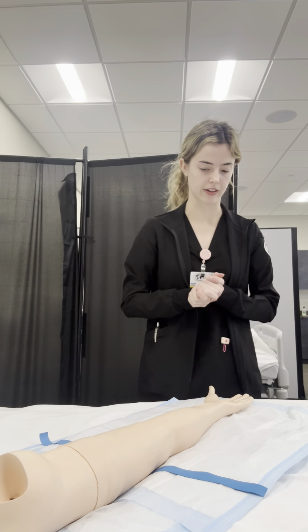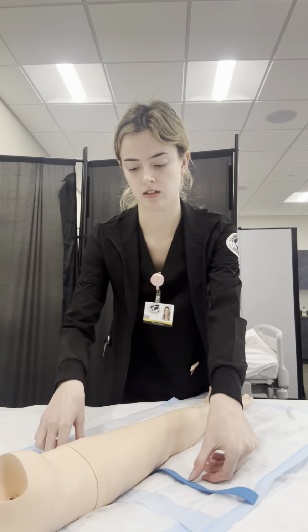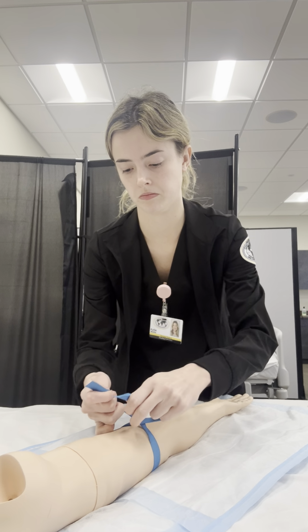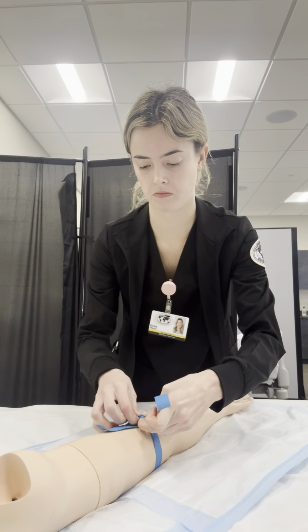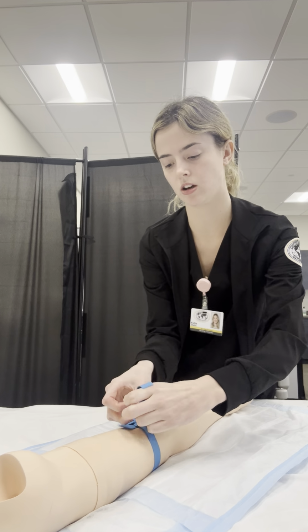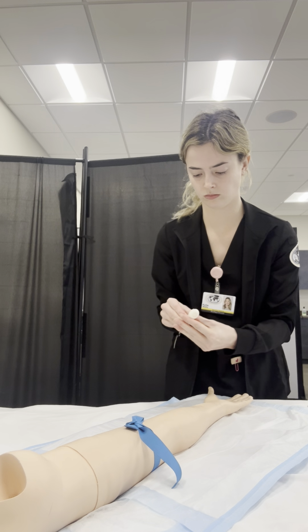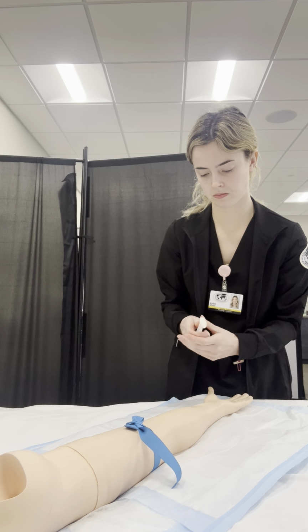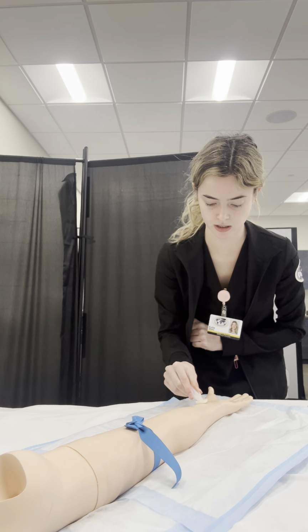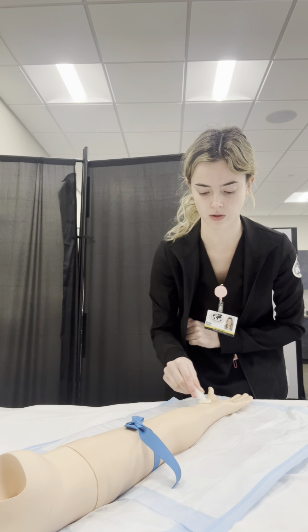So now that I have all that laid out, I am going to apply the tourniquet and cleanse the site. Okay, so now that the tourniquet is on, we will cleanse the site. And we're going to just go in circular motions for about 30 seconds, starting inward and then working outward.